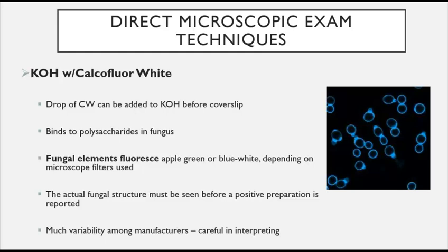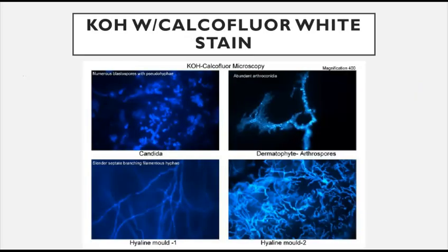The actual fungal structure must be seen before a positive preparation is reported. With this methodology, there's much variability between manufacturers, so be careful when interpreting results. Here's a few more examples of the KOH with the calcofluor white stain. You can see the fluorescence.